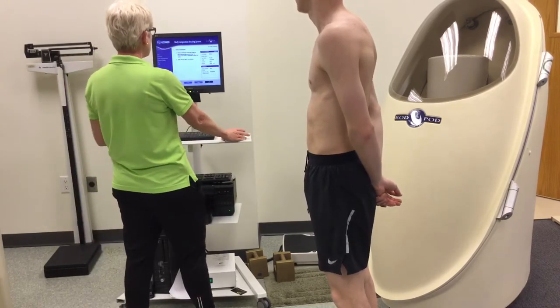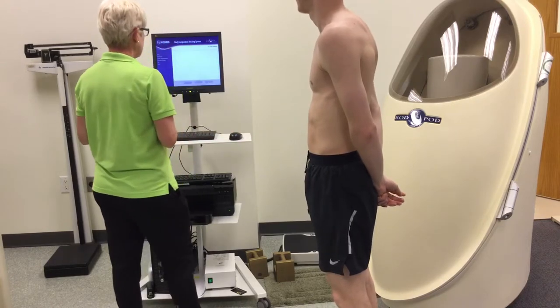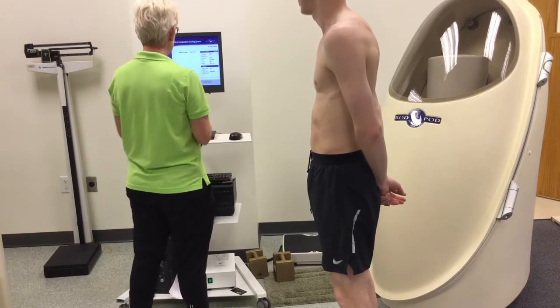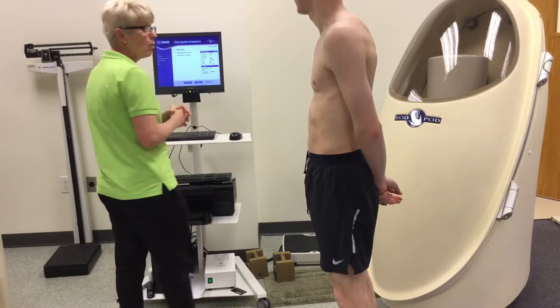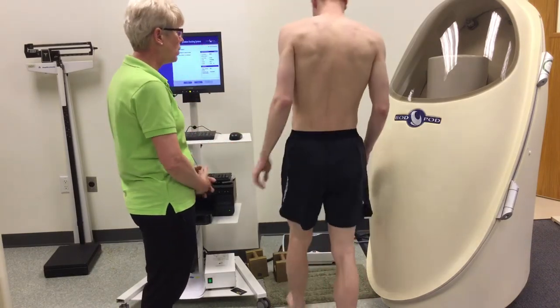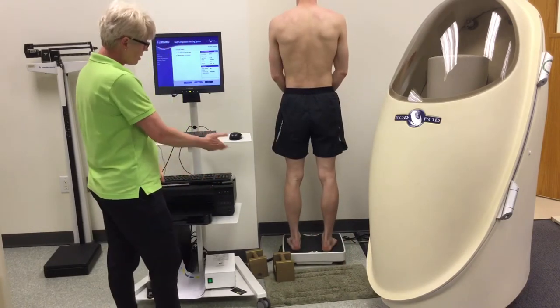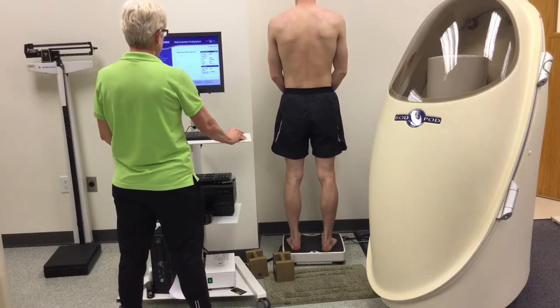Based on what the screen tells you, it's going to walk you through the steps. It's asking me to clear the scale. Now we're going to ask the subject to step up on the scale, face the wall, and do not wiggle — be as still as possible. Once the scale has recognized his weight, the blue will come up saying next. You just click next.